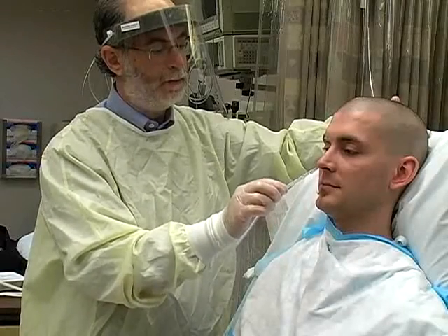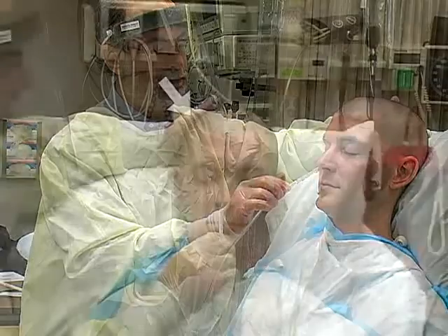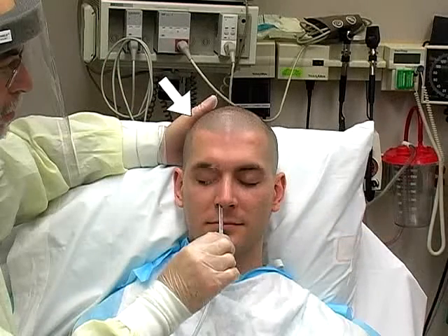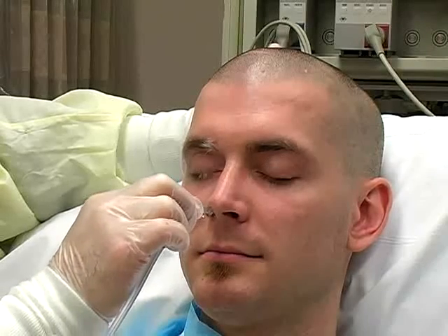Assure that the patient is sitting upright prior to inserting the tube. It may be beneficial to place your non-dominant hand behind the occiput to prevent the patient from suddenly pulling his head away. Carefully introduce the tip of the nasogastric tube into the selected nares and slowly advance it posteriorly, parallel to the floor of the nasal cavity.